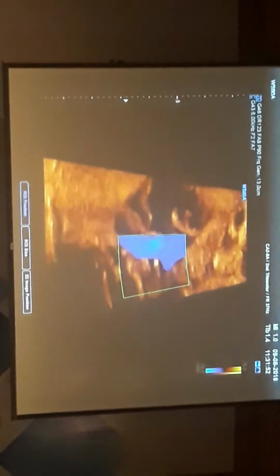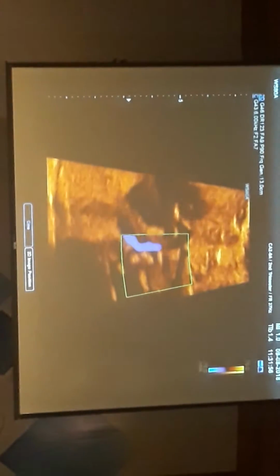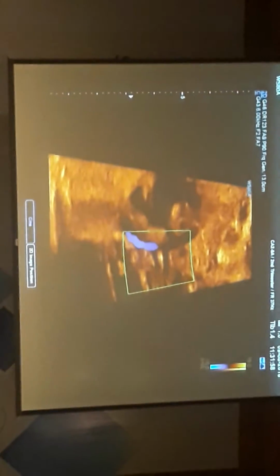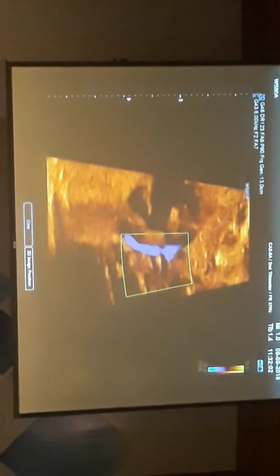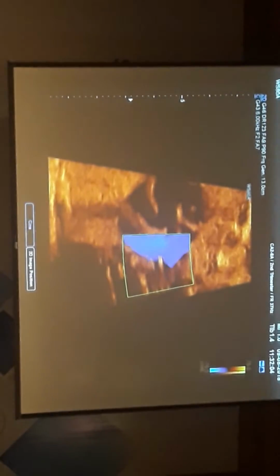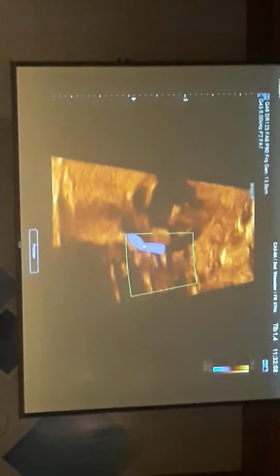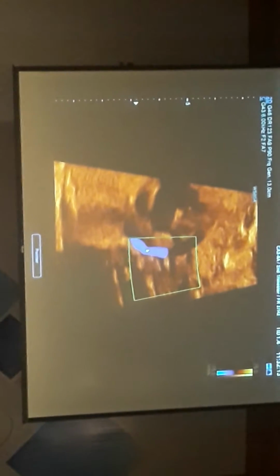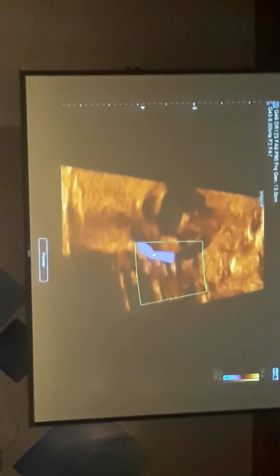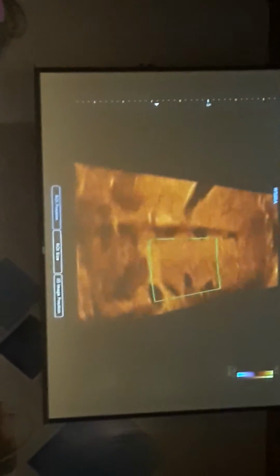Notice, see with the color, this is diastolic flow. Here's systole, here's diastole. So there's continuous flow during diastole, which we see sometimes with severe aortic obstruction. But it does not look interrupted.